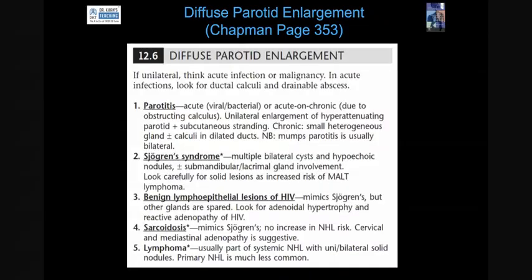Now, you have to remember this. This is extremely important, in your long cases, in your Viva cases, etc. These things are critical, which are asked for, particularly in long cases. They might give you this MRI, and with that, something in the hands. And the conclusion or the unifying diagnosis will be that this is RA, which is causing Sjogren's syndrome.